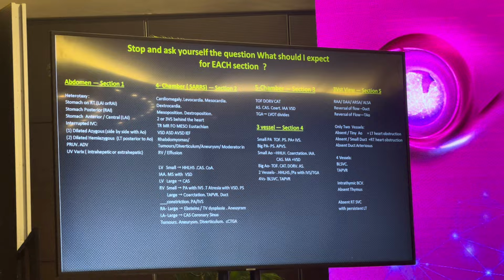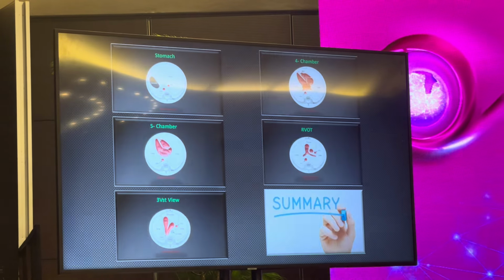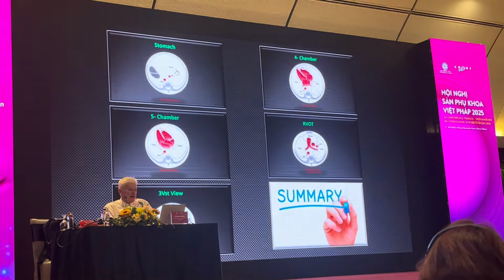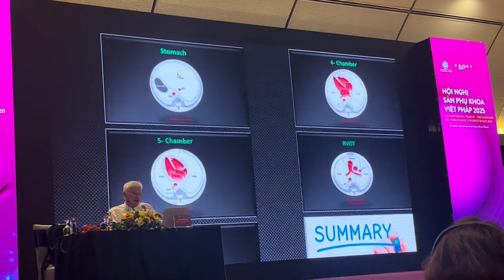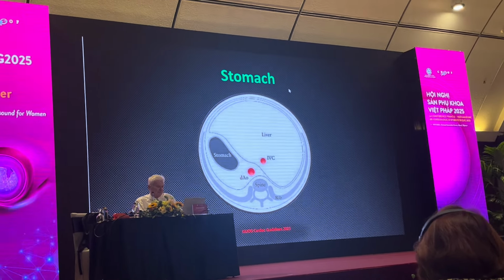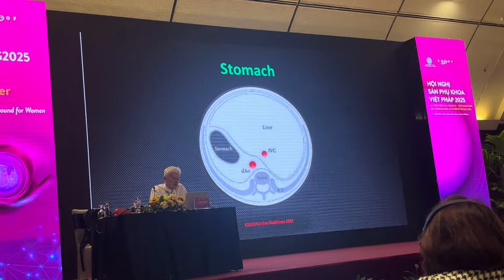And I will come back in my next, are we good to go? Yep, patient is just getting on the couch. And when I come back after the live scan, I will walk you through the abnormalities that we see on each section. Starting off with the first section.